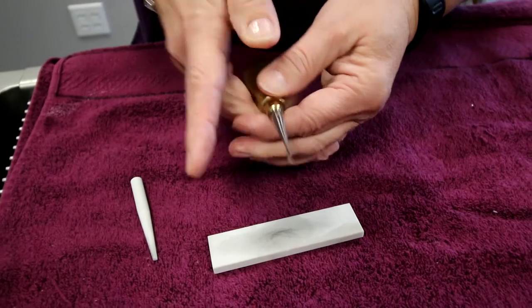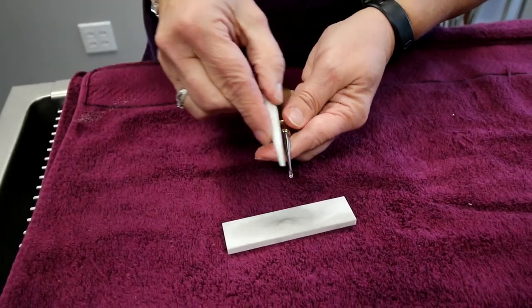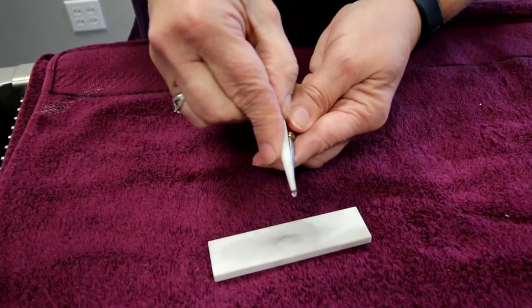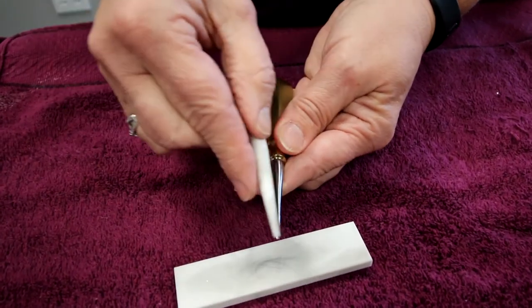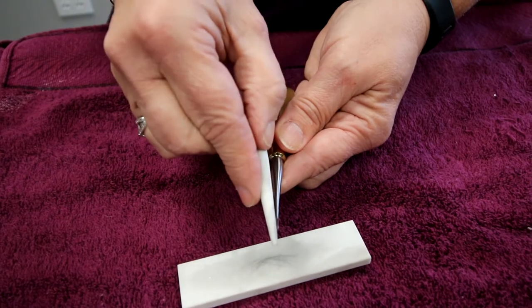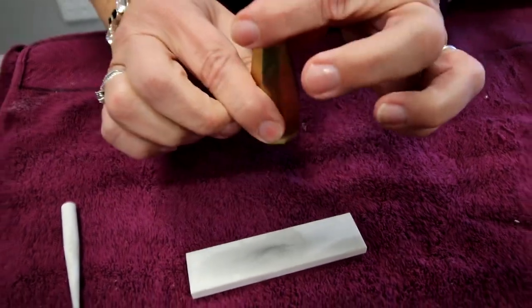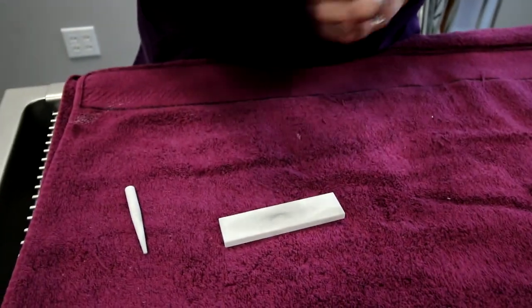Once I feel I've done enough with that back, I'm going to take my conical stone and go down in between the winged elevator, removing any burrs that might have been created when I sharpened it. Just make sure it's nice and smooth. Go ahead and autoclave it and it's ready to go for the next patient.